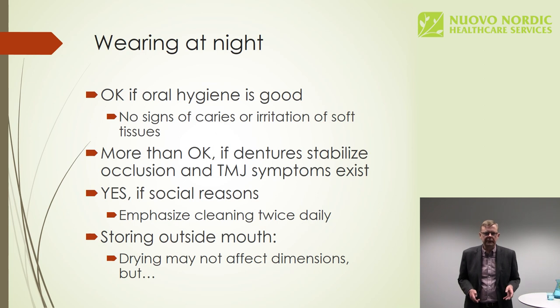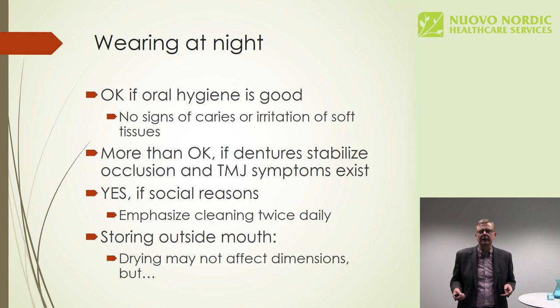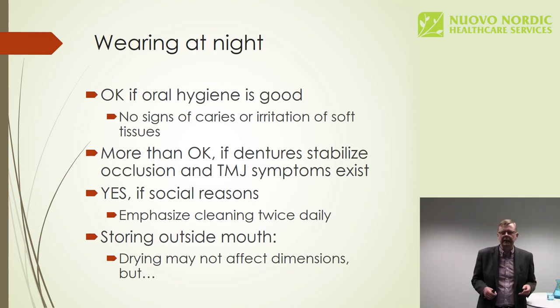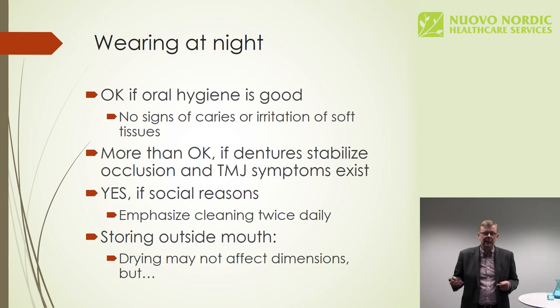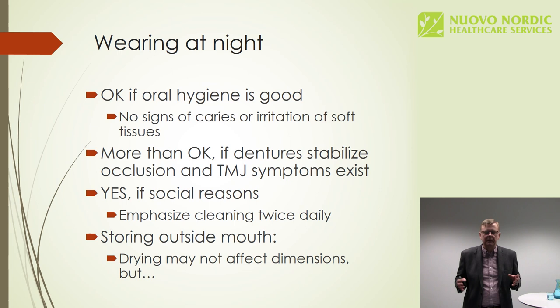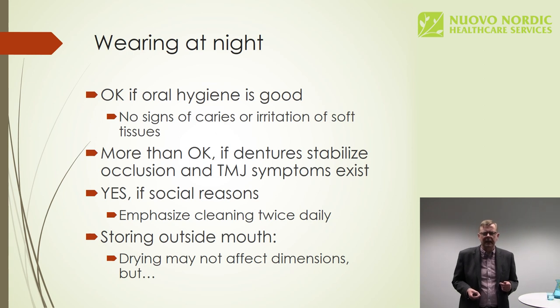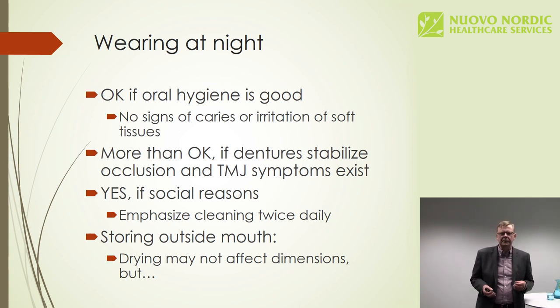The patient can use the dentures at night if he or she will brush them clean, carefully. Of course, the soft tissues will be happier if the dentures every now and then are not worn. For example, at night, the tissues will renew, the squamous epithelium will loosen and the remnants won't stay under the denture. There will be fewer pressure spots and tissue problems if the dentures are not worn at night. But as I mentioned, they can be worn if the oral hygiene is good.